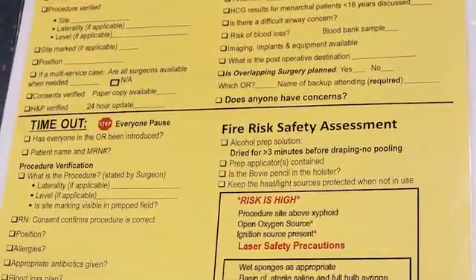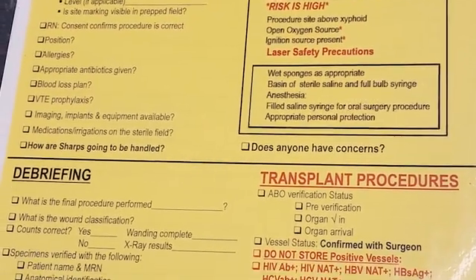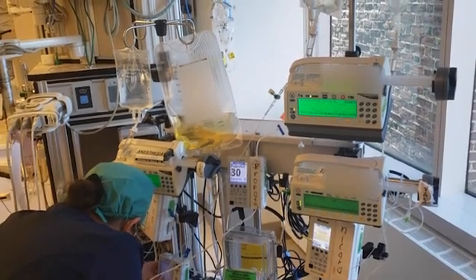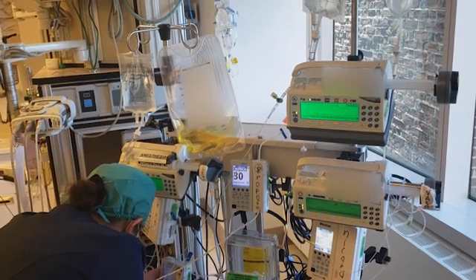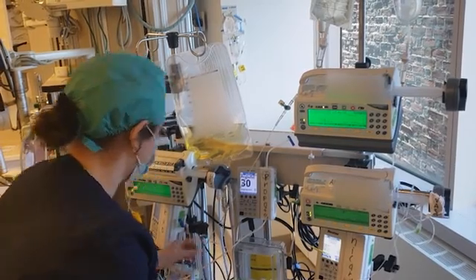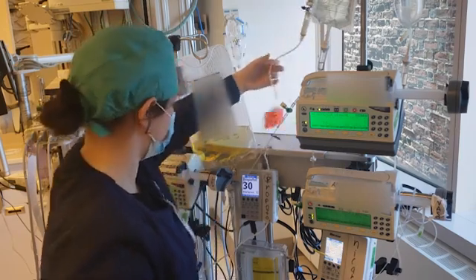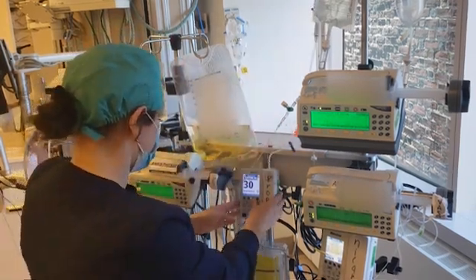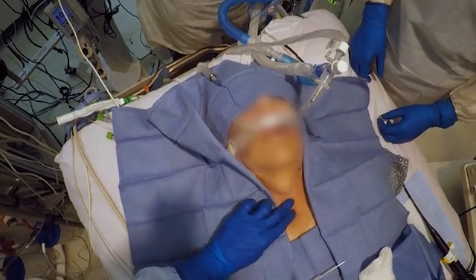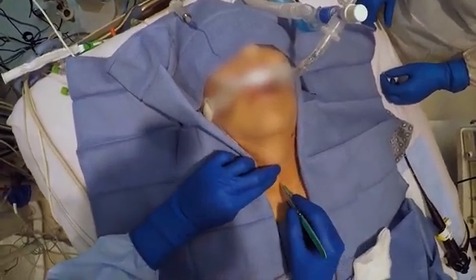Before starting the procedure, perform a pre-procedure timeout to verify the patient's identity and the procedure to be performed. After the timeout, ask the patient's nurse to administer a short-acting paralytic agent and, if necessary, additional sedation. Inadequate paralysis increases the risk of inadvertent extubation when the oral endotracheal tube is being manipulated. The nurse should then step out of the room to minimize exposure, but should be immediately available and ready to enter in case assistance is needed. Sterilize and drape the anterior neck, making sure that the draping allows easy access to the oral endotracheal tube.